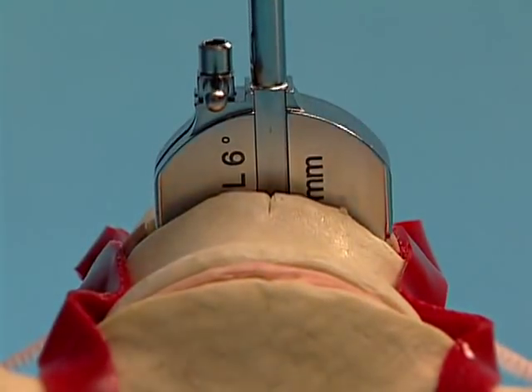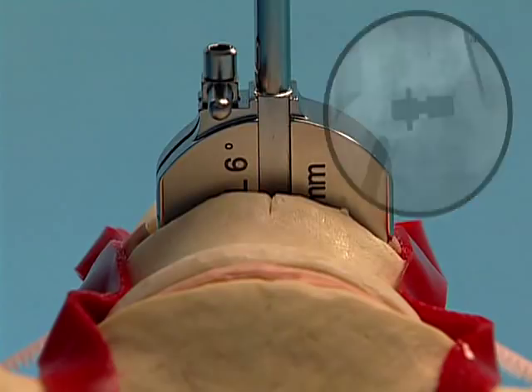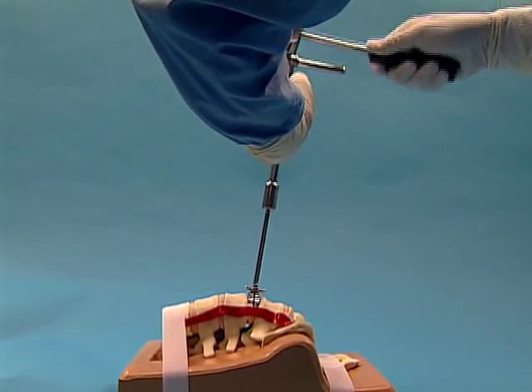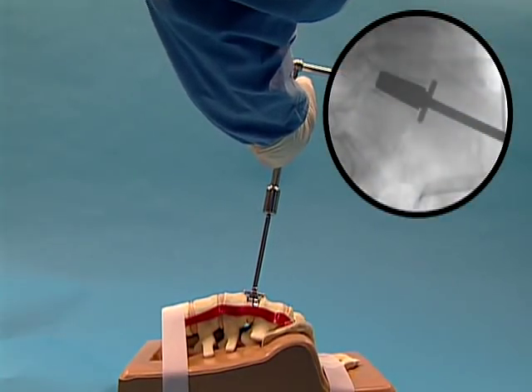Insert the trial into the disc space, centered on the midline mark and aligned with the sagittal plane of the vertebral body. Advance the trial to the posterior margin of the vertebral bodies with the slotted mallet. Confirm position under lateral fluoroscopic control.